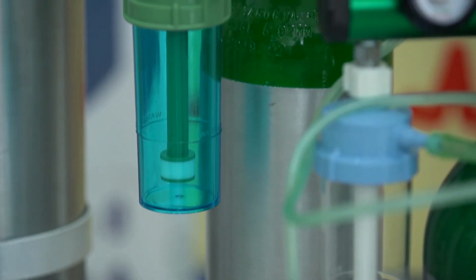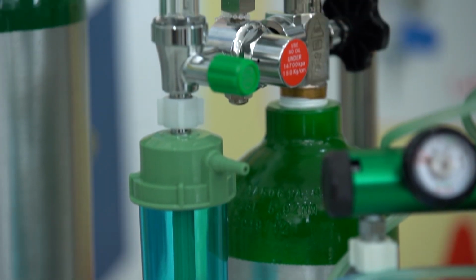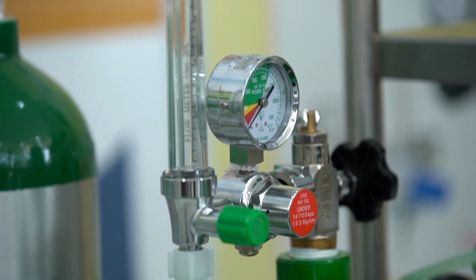The air in the atmosphere has 21% oxygen, but you can separate it from the air with the VPSA or PSA unit. That's how we fill the cylinders.